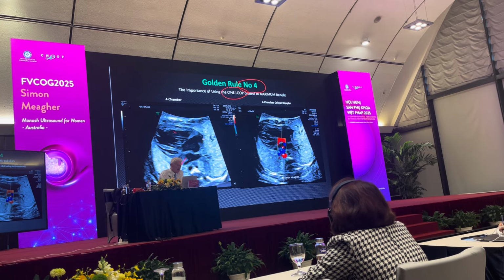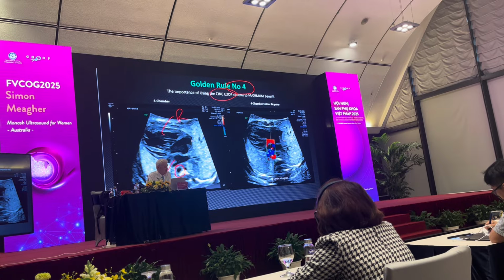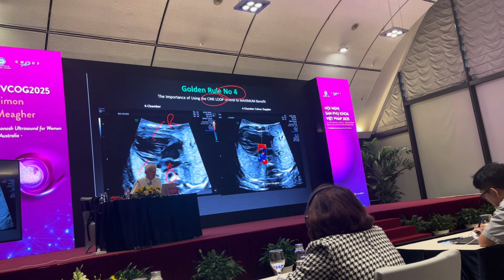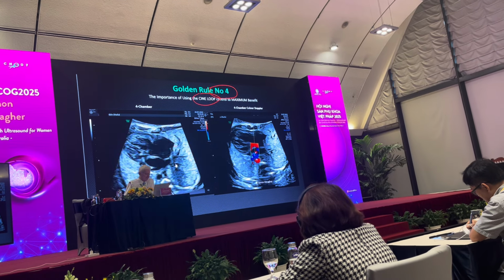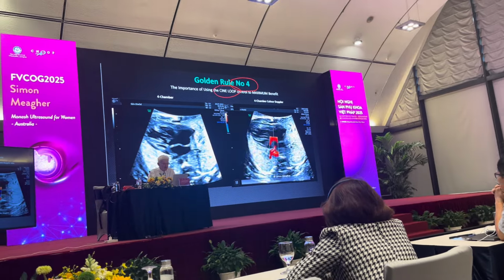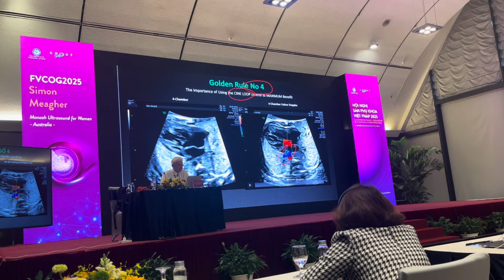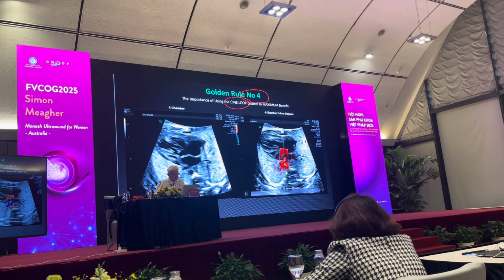How do I know that this is the right ventricle? Because this is the descending aorta. So if that's the descending aorta, that's the left atrium and that's the left ventricle. So if I play the video clip on this, I then look at color Doppler and I see red, blue, because I'm experienced and I can see that there is bidirectional flow in the pulmonary veins.